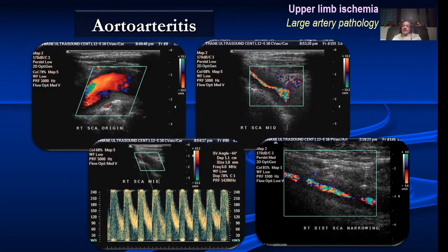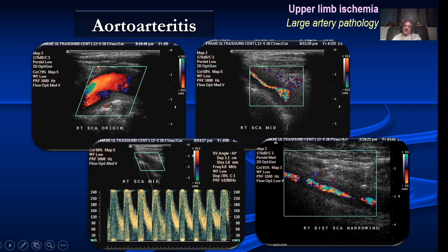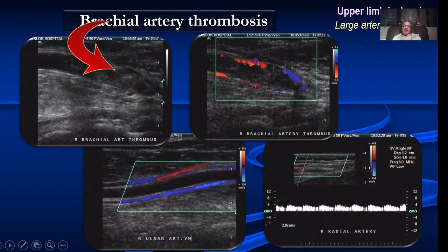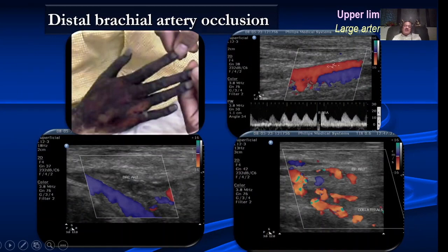Aortoarteritis is very common in the upper limb. Typically the subclavian artery is very often affected — you get a long segment of wall thickening in the subclavian or carotid artery, which is very classical of aortoarteritis. We can also have axillary stenosis with aliasing, disorganized flow channels, and very high velocities. We can have brachial artery occlusion — note the number of collaterals that come up in the upper limb, though this patient had dampened flow distally. This lady had severe discoloration of the hand caused by brachial artery occlusion with both ulnar and radial arteries also occluded.